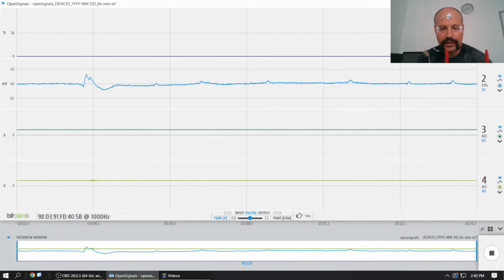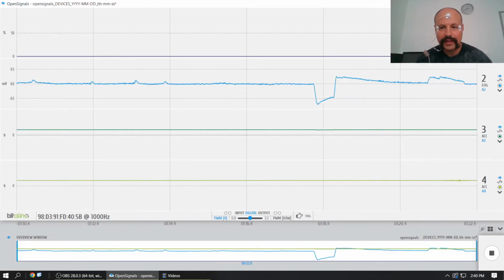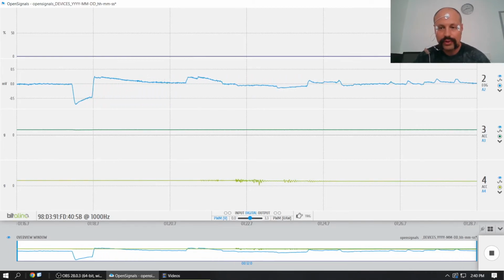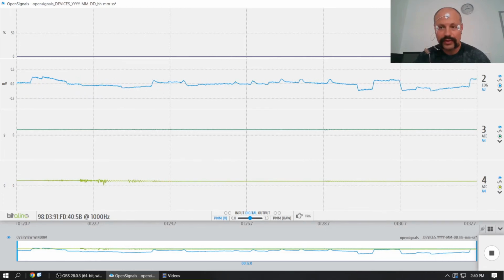Now I do about the same thing, but with the opposite direction. A brief saccade to the left and back. And now it is negative. And it is easy to identify the latency of the response quite precisely as soon as you know the onset of the stimulus.